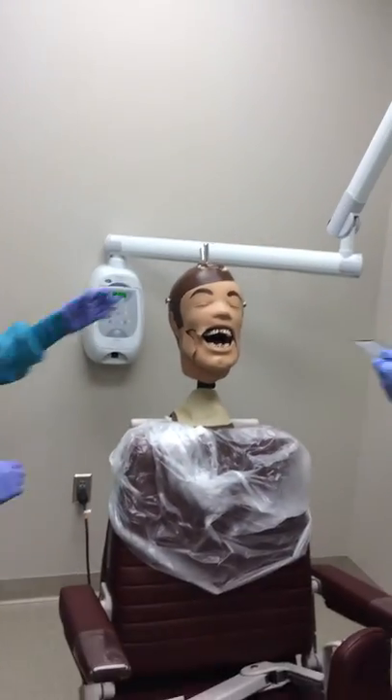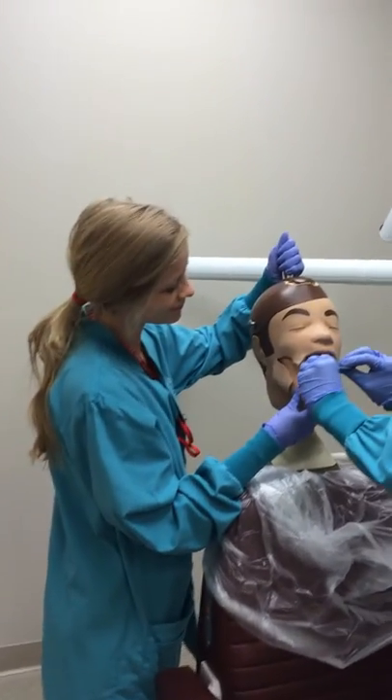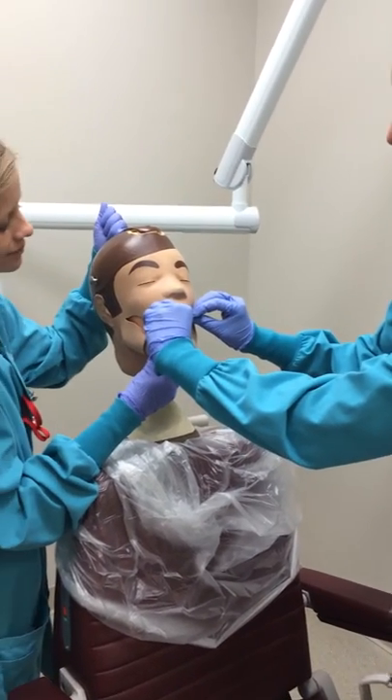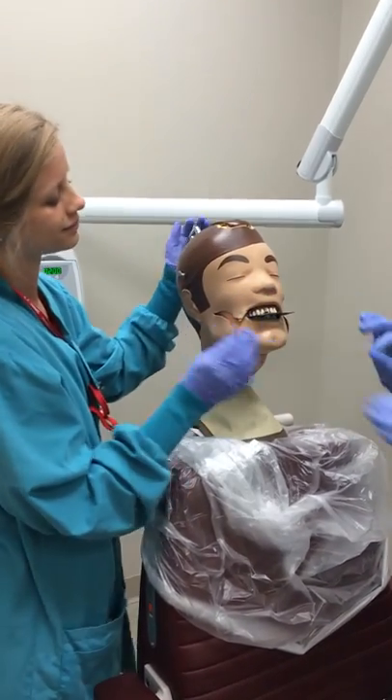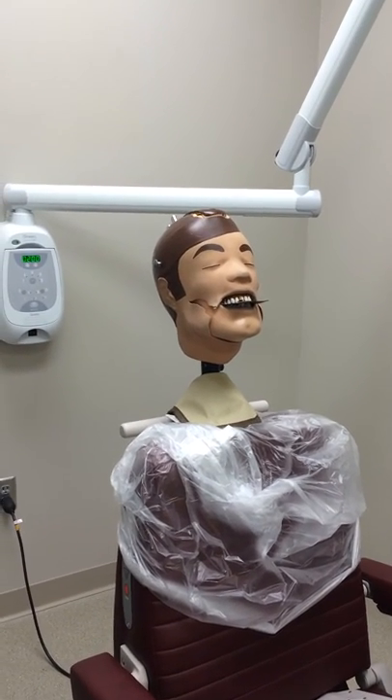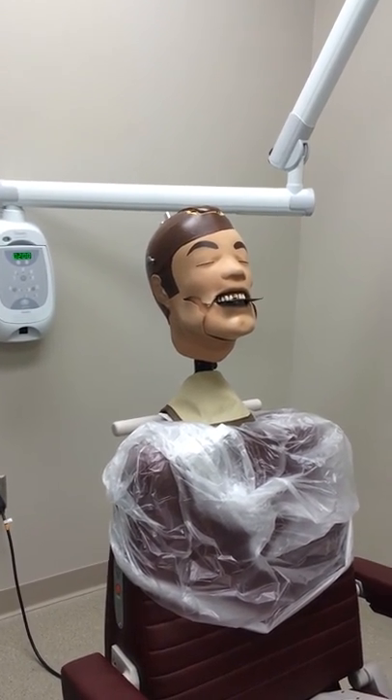Place the size 4 phosphor plate in the patient's mouth, keeping their occlusal plane parallel to the floor. A size 2 plate would be used if you were taking the radiograph on a child. Keep 1 cm of the plate anterior to the maxillary central incisors.